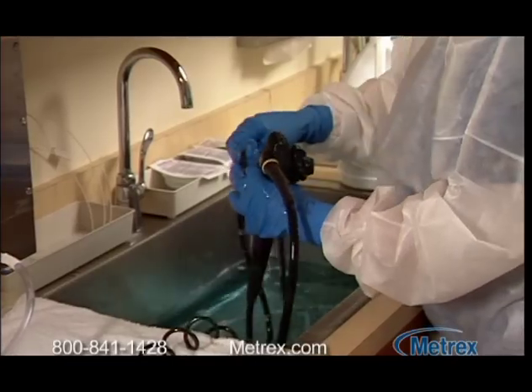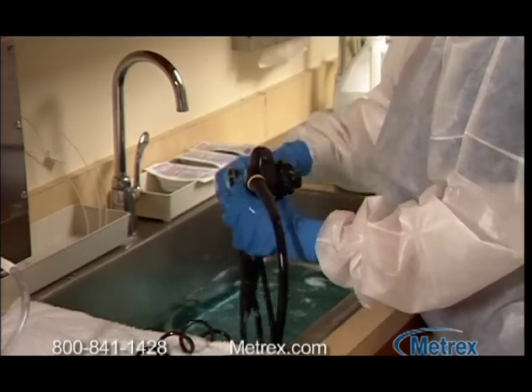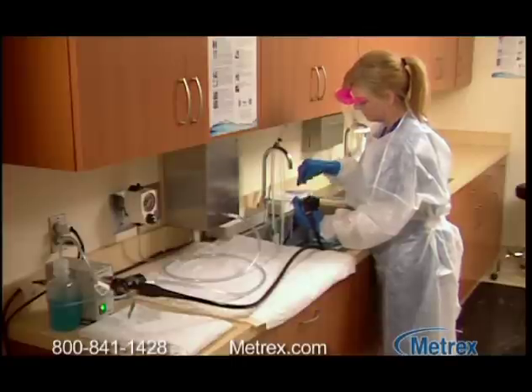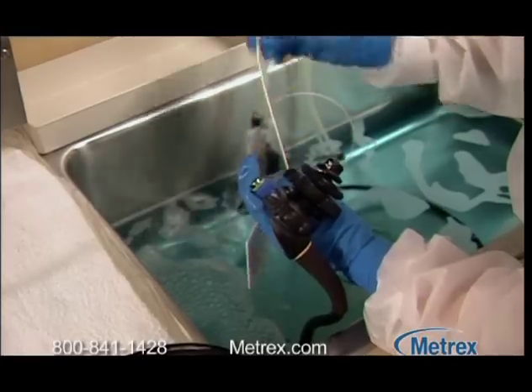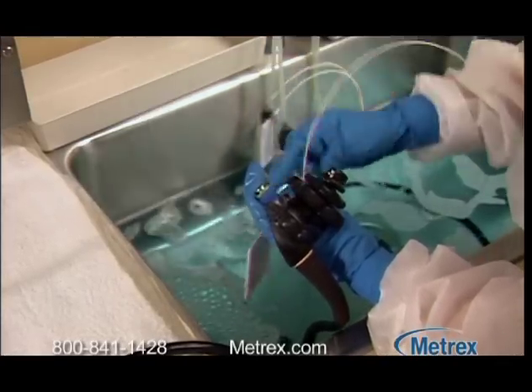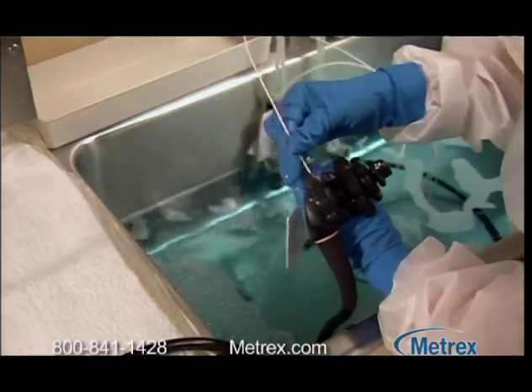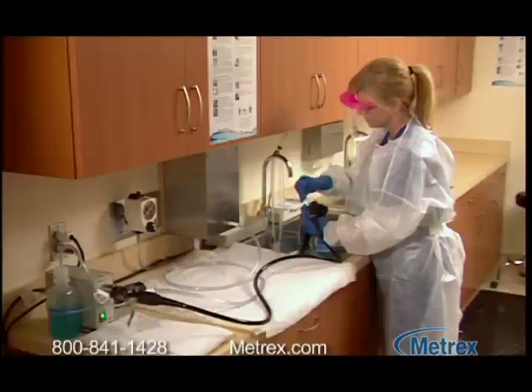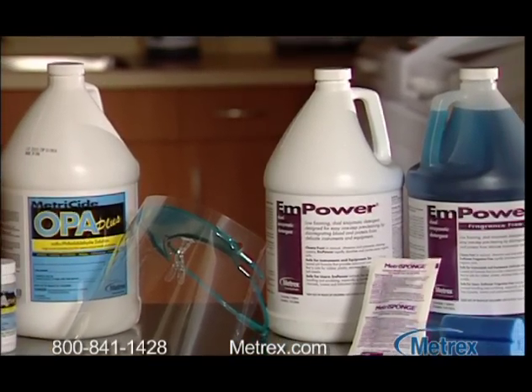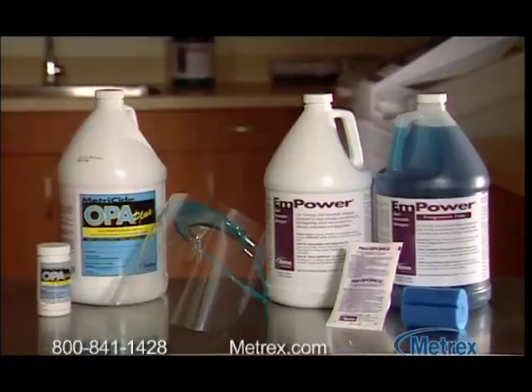Metrex sponge removes dried bio-burden with a specially contoured sponge saturated with Metrazyme heavy-duty dual-enzymatic detergent. It fits snugly around cylindrical instruments to remove gross contamination prior to immersion. After scrubbing the exterior of instruments with Metra sponge, continue cleaning in a container filled with a diluted concentration of M-Power dual-enzymatic detergent until all soil is dissolved. M-Power works fast to remove blood, tissue, mucus, and other protein-rich body fluids. M-Power and Metricide OPA Plus are engineered to work together to clean and disinfect semi-critical devices.